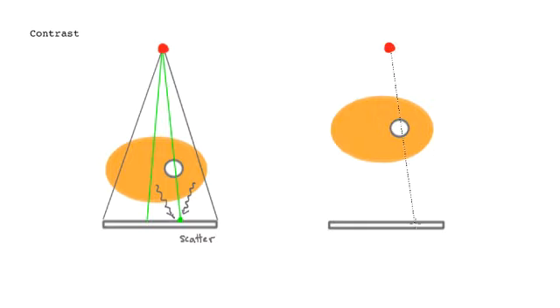Now, if we consider this geometry where we move the patient up, what you see is actually the scatter conditions are a little different. So if you have photons scattered here, it goes out and it doesn't reach the detector, right? So you get less scatter at this position. So the scatter component is affected by the geometry. It's also affected by the thickness of the patient. Smaller anatomical region will have less scatter, and it's also affected by the field size in the two dimensions.